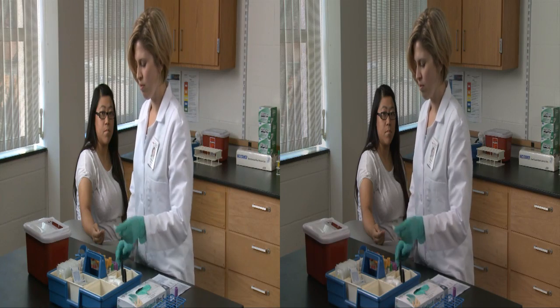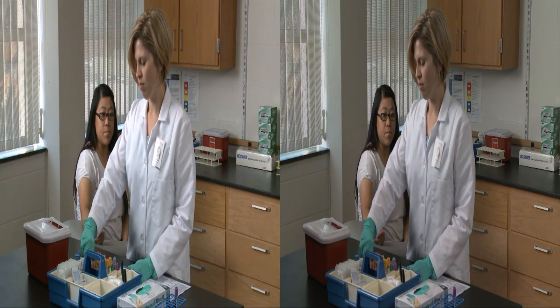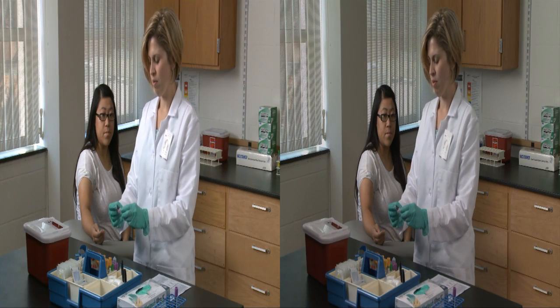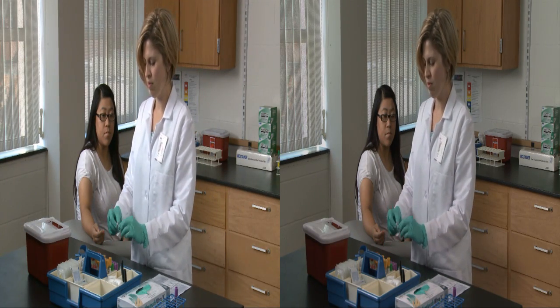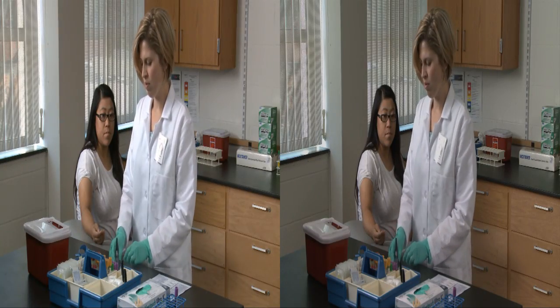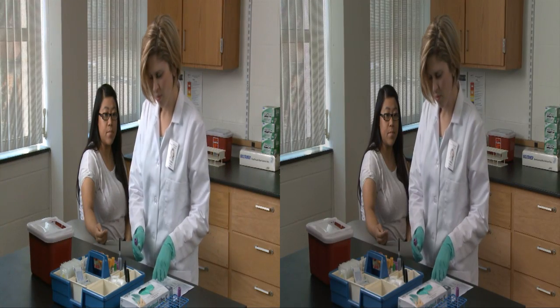Two keys to a successful multiple-tube draw must occur in the planning stage. You need to determine which gauge needle will be appropriate for all tests being requested, and you need to plan the order of the draw to assure the integrity of all samples. But your technique should remain the same.